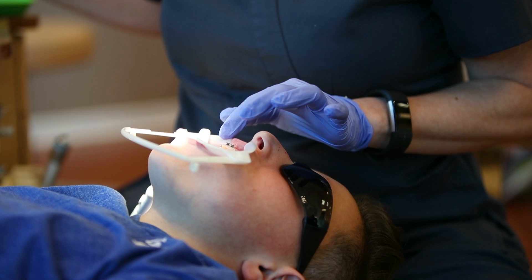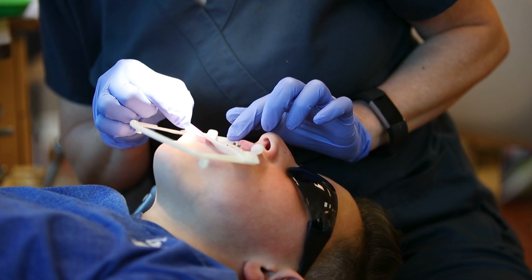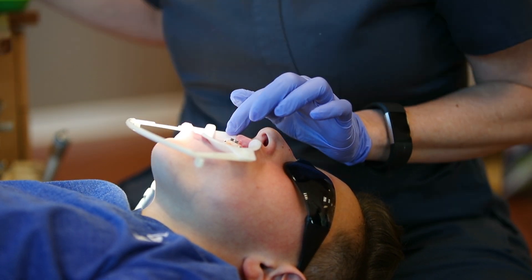Bite blocks are used to help teeth move more easily and quickly. They prevent you from biting too hard and breaking braces off. They also help fix deep bites when the top teeth cover the bottom teeth too much.